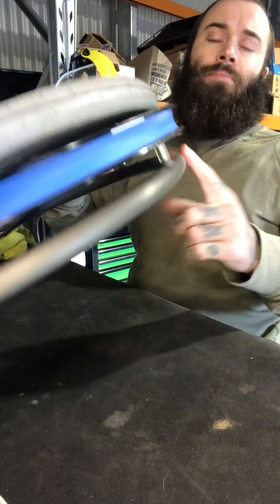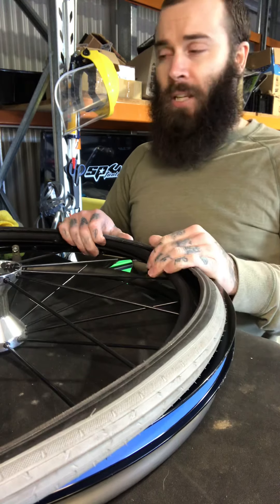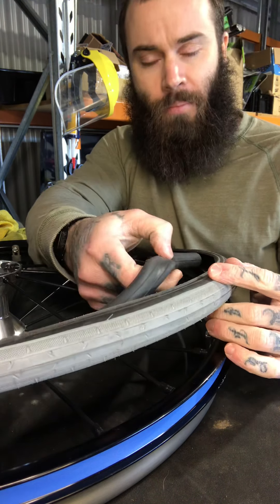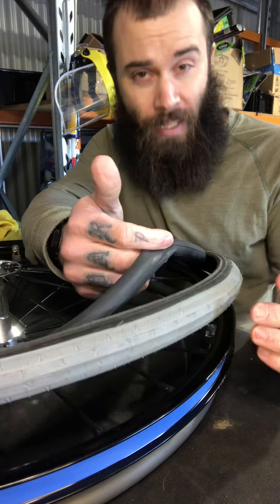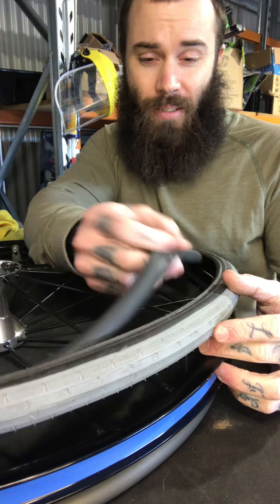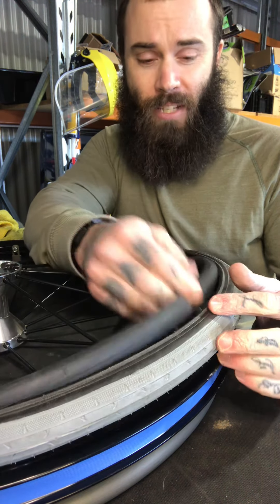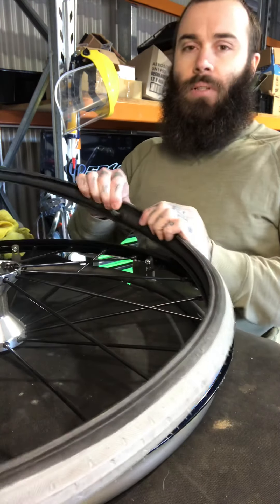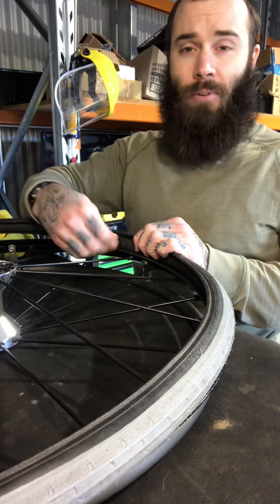Roll it around, hole lined up nice and neat. Always do this from the opposite side of the push rim. I've already pulled out the tube — grab the tube, inflate it with a bit of air to give it shape, then stick it inside the tire. Take the valve cap off.